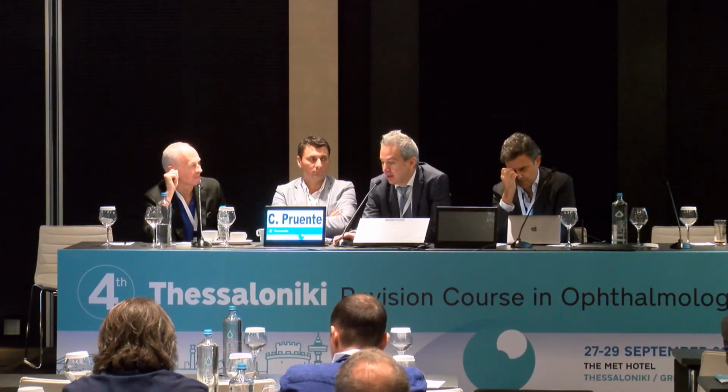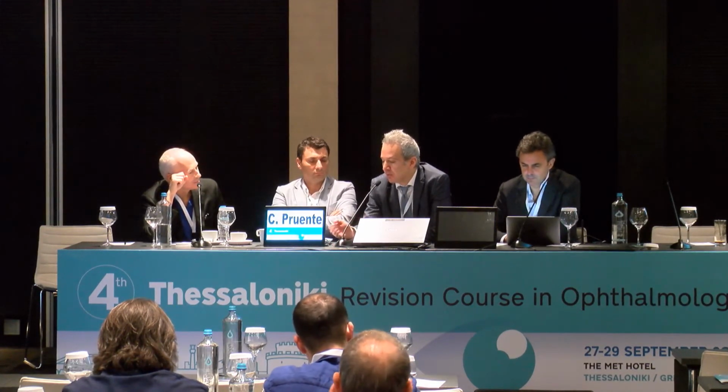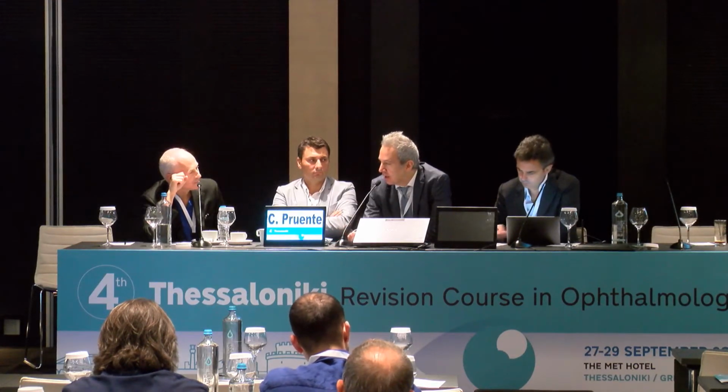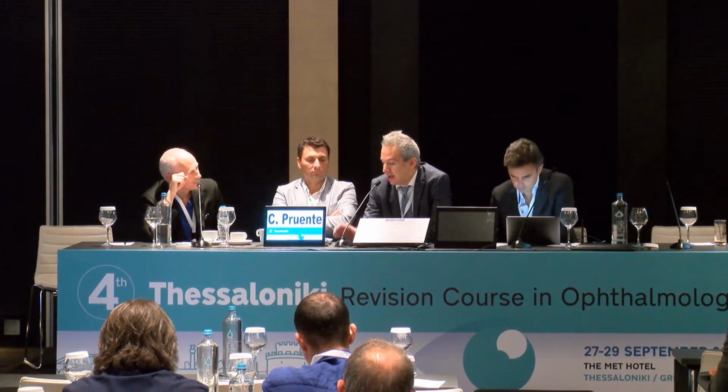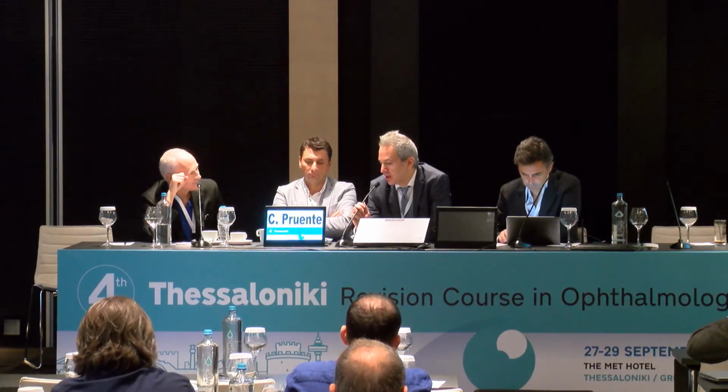We don't really know what is the refractive effect of cross-linking, accelerated cross-linking. We know very much about the Dresden protocol, and we know a lot about biomechanical effects of accelerated cross-linking or other types of cross-linking, but the flattening effect, the long-term refractive effect of accelerated cross-linking, I think we need to know much more about this. In my opinion, refractive procedures in terms of wavefront-guided or PTK combined with cross-linking should be spared for selective patients, patients who are willing to take some risk, because there is always a risk in this procedure, and patients who are desperate to have their vision improved.